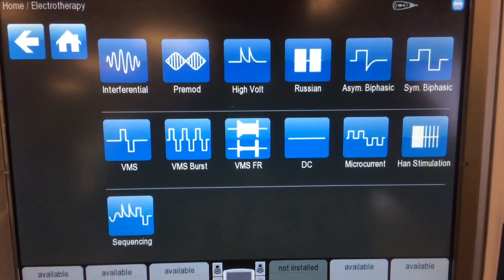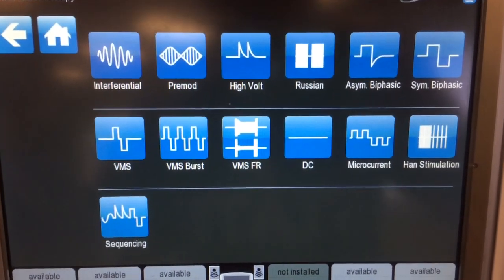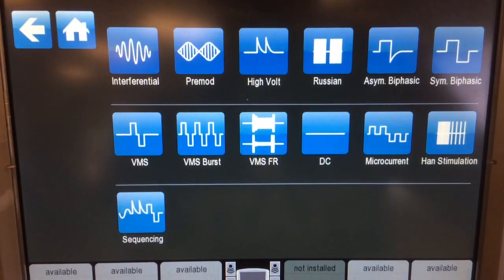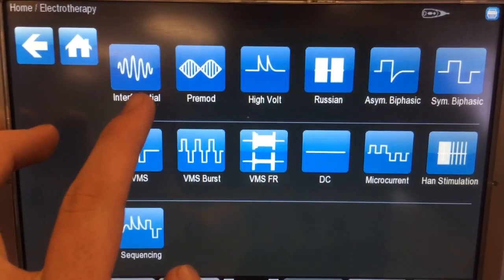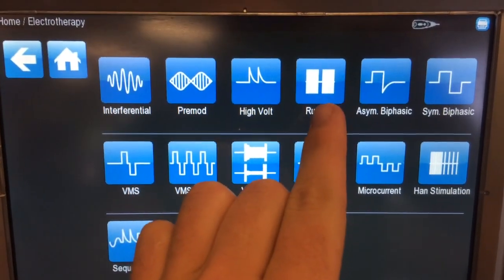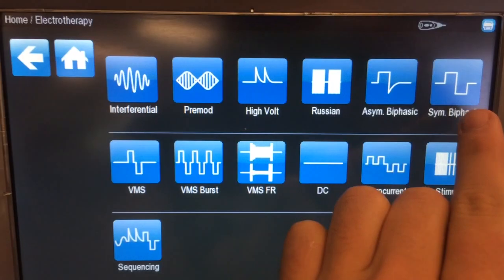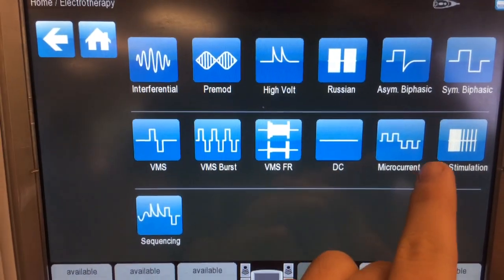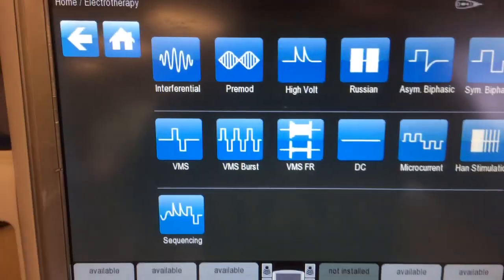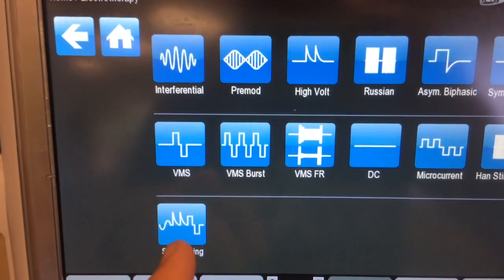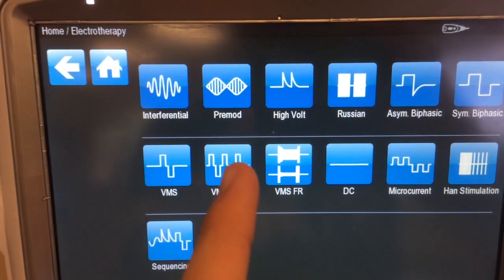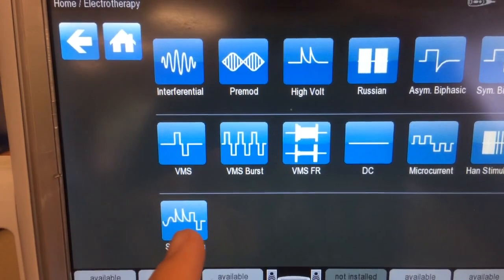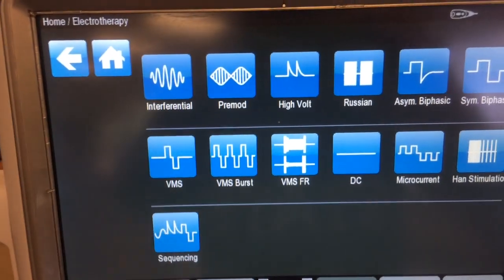Here's a good list of different waveforms available on the machine in the main athletic training room: Interferential, Pre-mod, High Volt, Russian, Asymmetric Biphasic, Symmetric Biphasic, VMS, VMS Burst, DC, Microcurrent, and HANS Stimulation. We can also use sequencing — a mixture of different parameters and frequencies waveforms going at the same time, going from one to another in sequence.